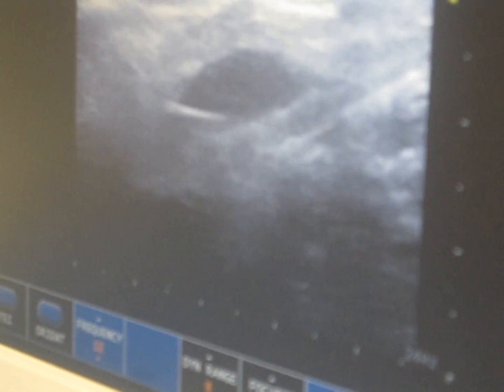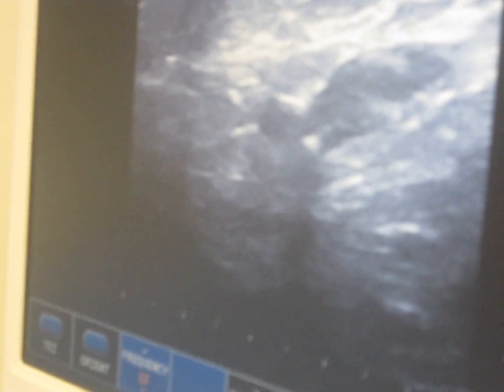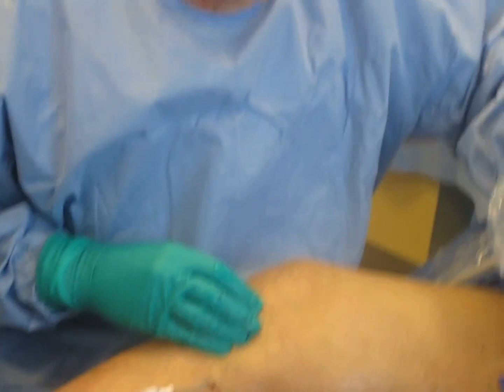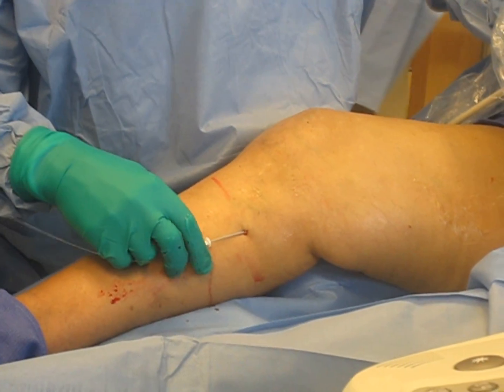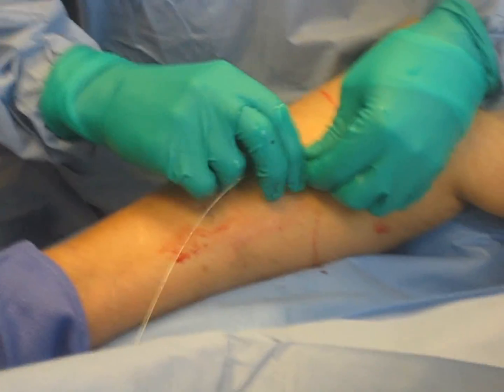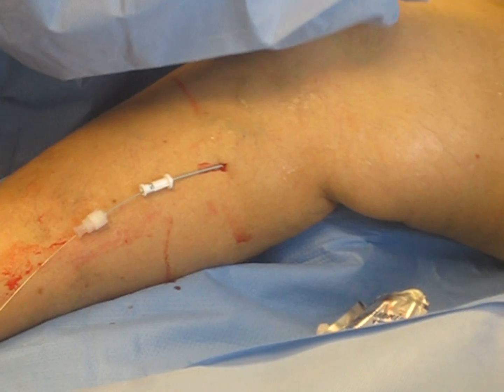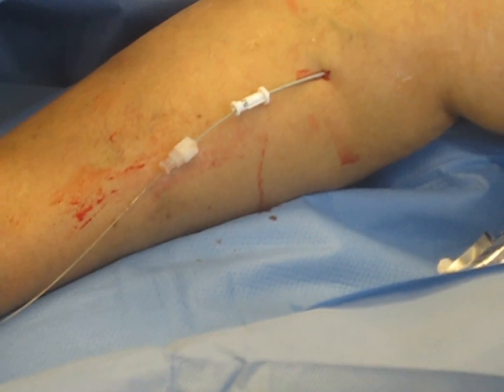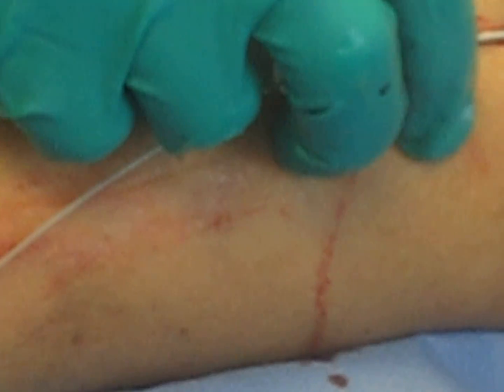That's our junction right up here. Our goal today is to show you this entire procedure from beginning to end so you'll know what to expect when you come to see us. We're going to pull our wire back and take our inside catheter, which has what's called a small dilator. The dilator has a little point on it so that it can go through the tissue.